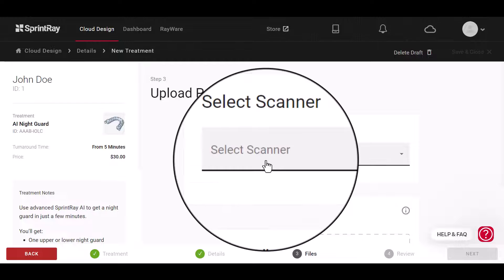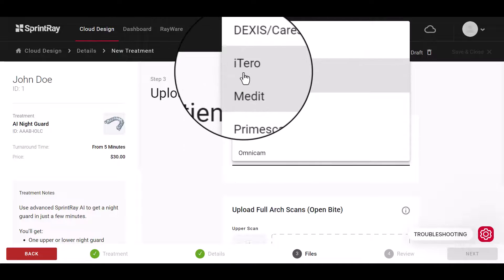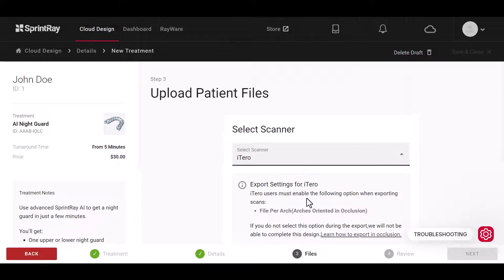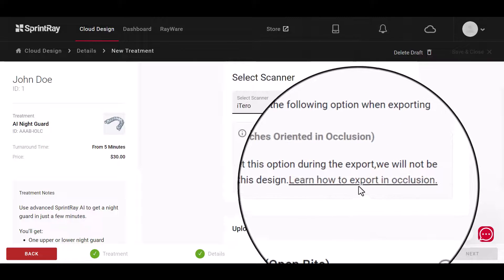Next, select your scanner brand. If you are using an iTero, remember that you will need to check that the files per arch option is selected when exporting your files. You can click the following hyperlink to learn more.